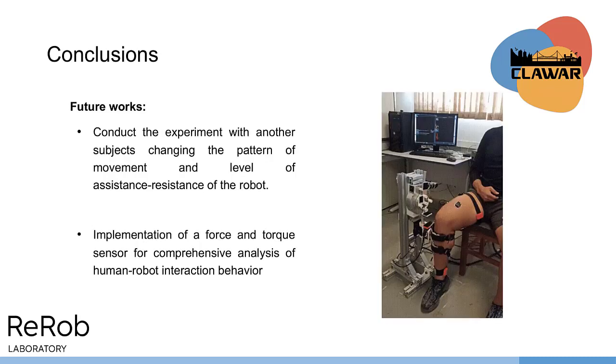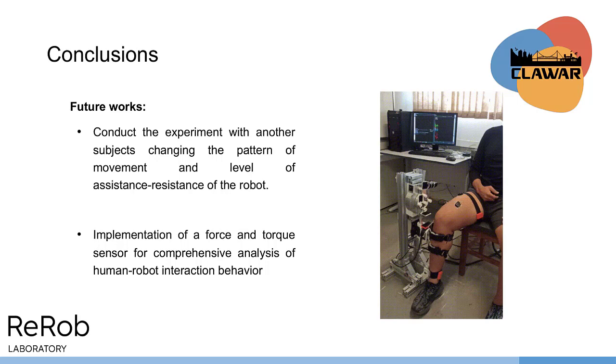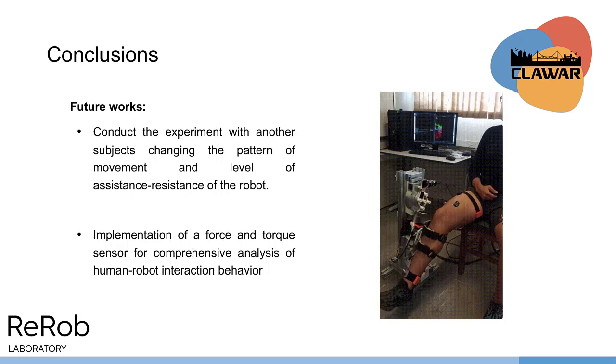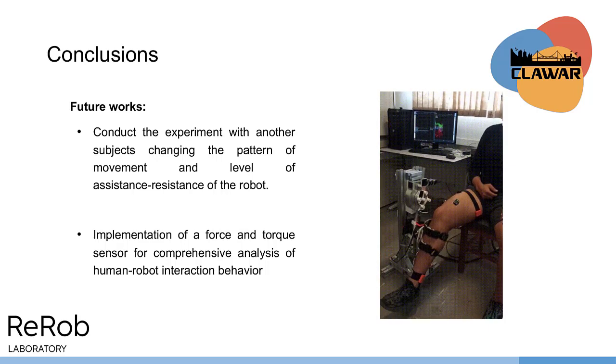It is required to conduct the experiment with other subjects, changing the parameters of the movements and the level of assistance and resistance of the robot. Additionally, we are considering the implementation of force and torque sensors to enhance our analysis of human-robot interaction behavior.